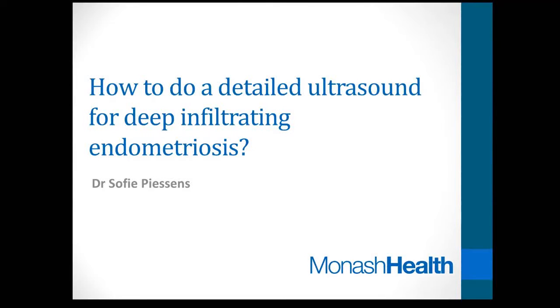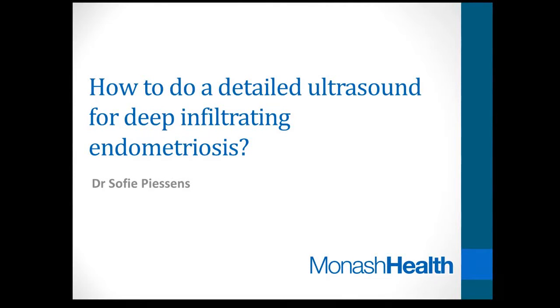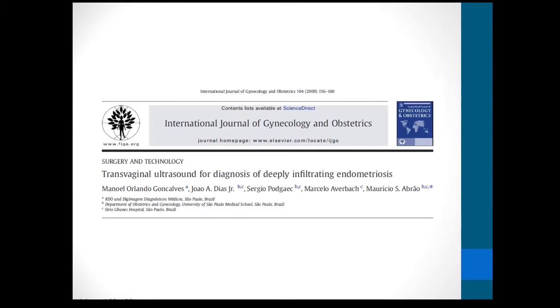This presentation will focus on how to do a detailed ultrasound for deep infiltrating endometriosis. The technique described in this presentation has also been published by Manuel Gonçalves and Mauricio Abrao in this publication. It is a good idea to familiarize yourself with the different forms of endometriosis and how they present on laparoscopy, so that you have a better idea of what to look for on ultrasound.